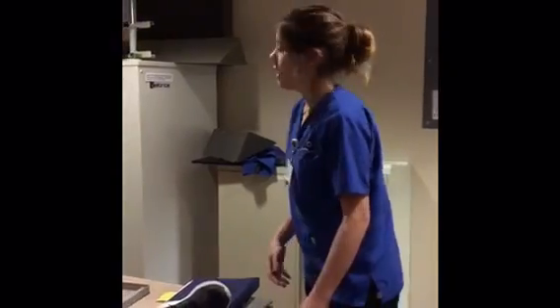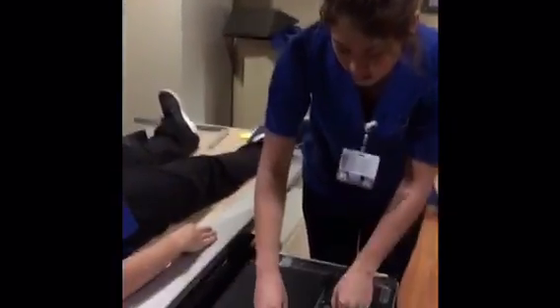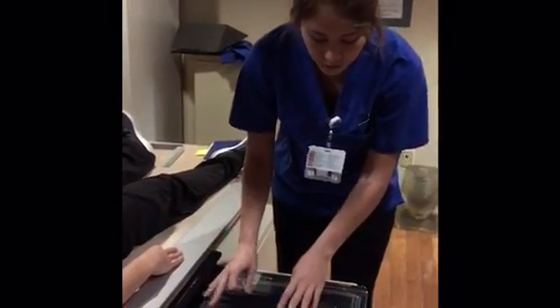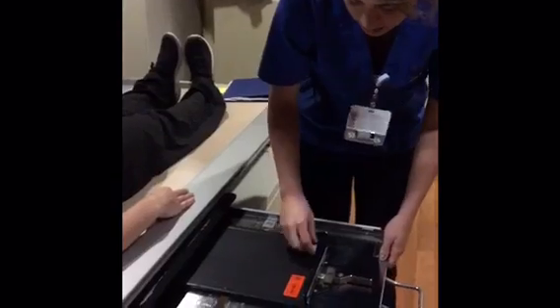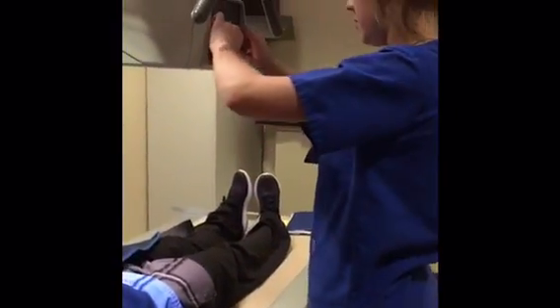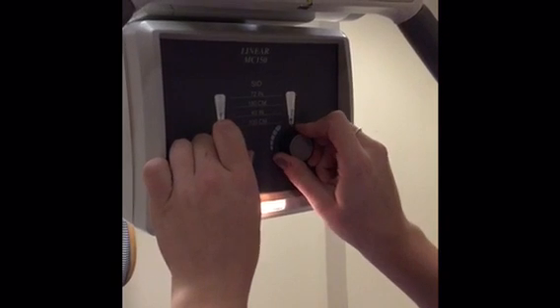After my AP exposure, I will walk back into my room and set up for the lateral projection of the hip. The first thing I will do is get a new image receptor, still using the 10 by 12, and this time we will move the image receptor to crosswise, still keeping the right-sided marker on the right end of the receptor. Now I will change my collimation from a 10 by 12 lengthwise to a 10 by 12 crosswise.